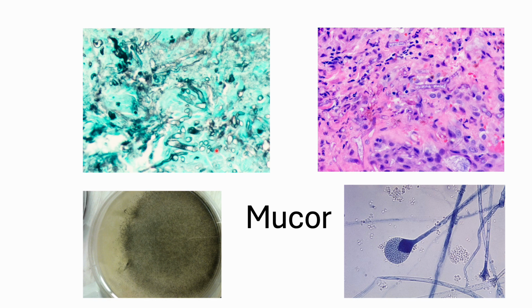So evaluation on the tissue for the fungus is not reliable. So I strongly recommend you not to tell the clinician what type of fungus it is based on the tissue. You should only tell them it should be a deep fungal infection, but don't ID it until you have the culture result.